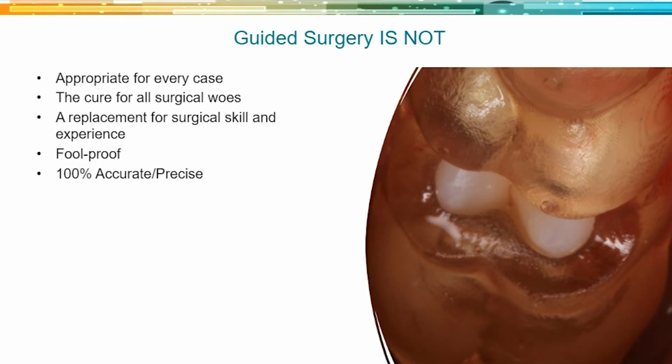And what I've learned the longer I've done implant surgery is if you understand the freehand surgery, or you understand why drills go where they go, we'll talk about this in more detail, you can avoid a lot of this problem, right? Just a quick example, if we're drilling against a really thick lingual plate, for instance, and we plan the implant right where we want it to be, which happens to be engaging or halfway in the lingual plate, well, that's not physically going to happen. The drills will refuse to drill through the lingual plate. They will get pushed aside from it. And so what you thought was the perfect guided surgery is still getting forced.